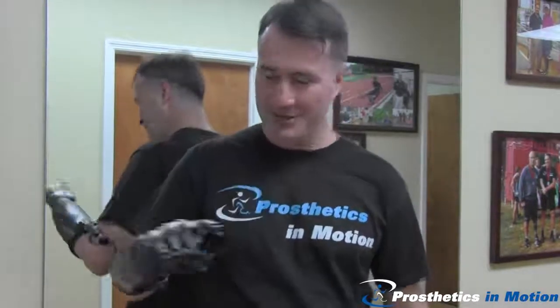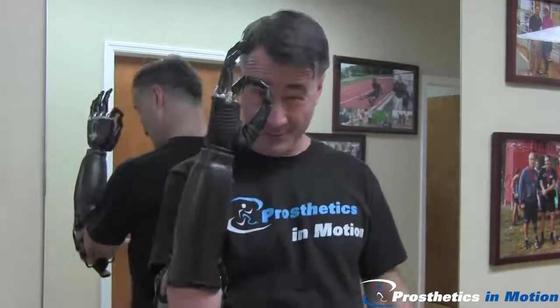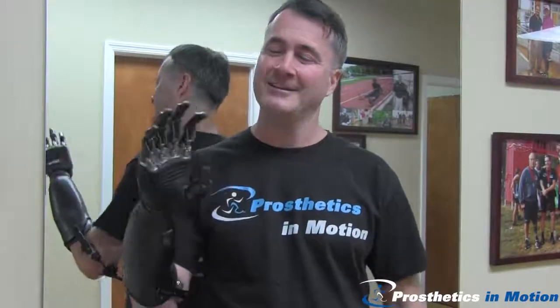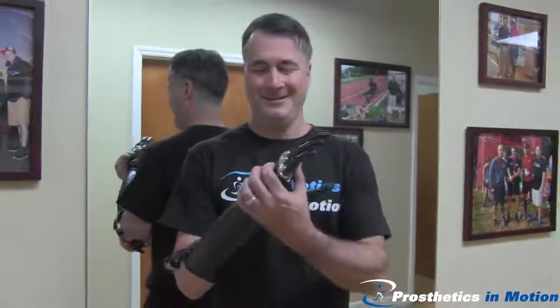Index point, also good for the keypad on the computer. Move the thumb — precision pinch. And this one is an active index; you can actually do a spray bottle. And back to the beginning.